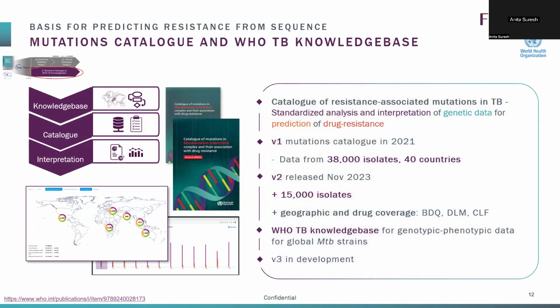I think we can't actually separate the whole mutations catalog and the interpretation story from the clinical evaluation aspect of sequencing. This is true for any molecular test, but more so for sequencing, because you're getting so much data from it, as you know. But it's so important that we know exactly what to do with it. It's not data for the sake of it; every single thing that you collect should be of use, and in this case, truly of use to actually direct treatment, right? So that's why this was a very important endeavor.